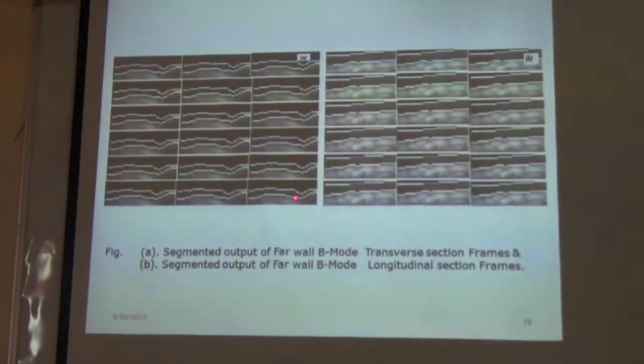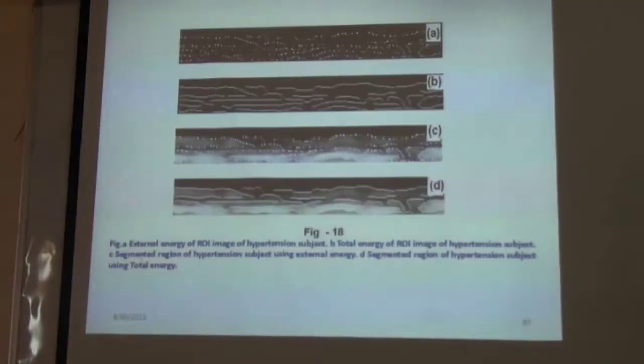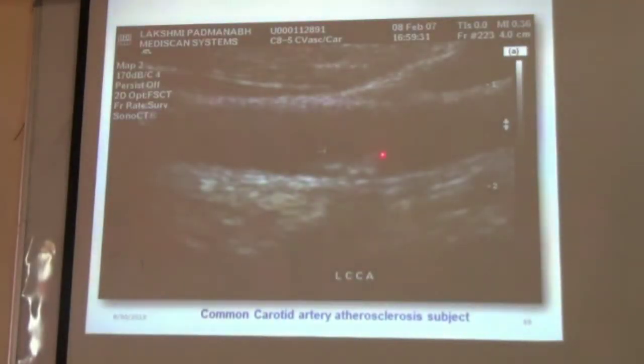Okay, but in this dynamic programming segmentation, see here. Here also the appearance is lumen. Here also that small portion appears as lumen. It can't segment in a perfect way. Whereas here, proper segmentation is done. Still there are small variations in that one. See here. Could you identify this one? Some atherosclerosis portion is there.